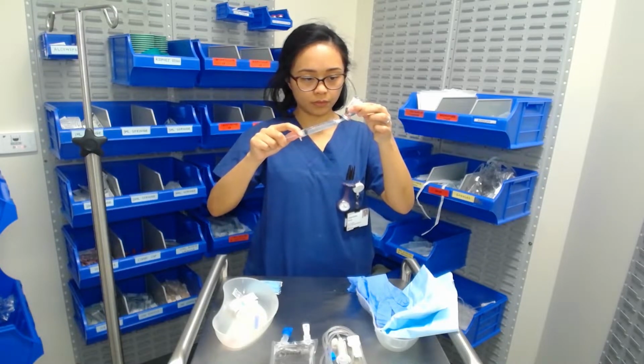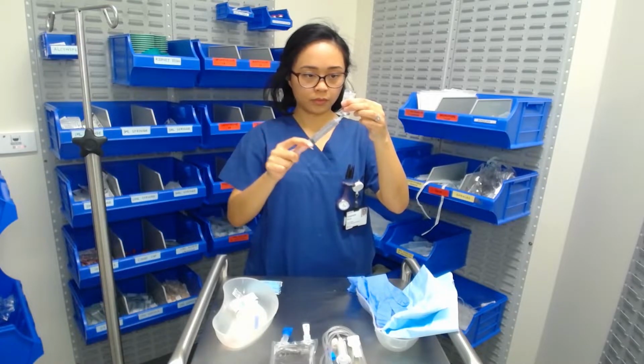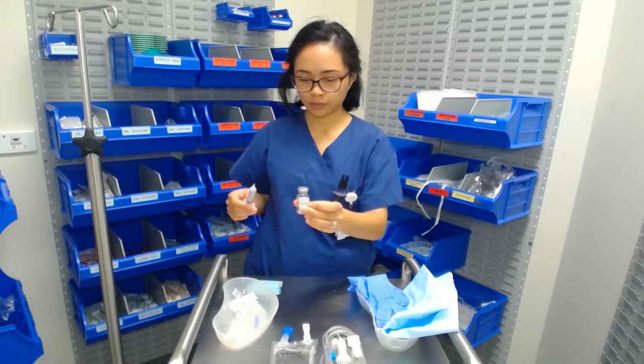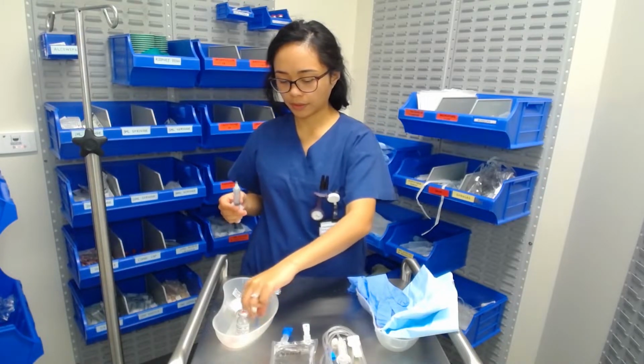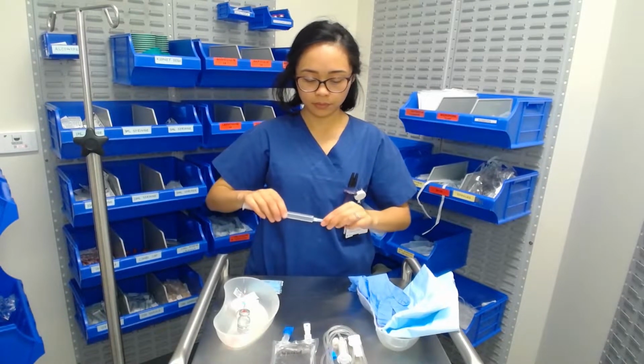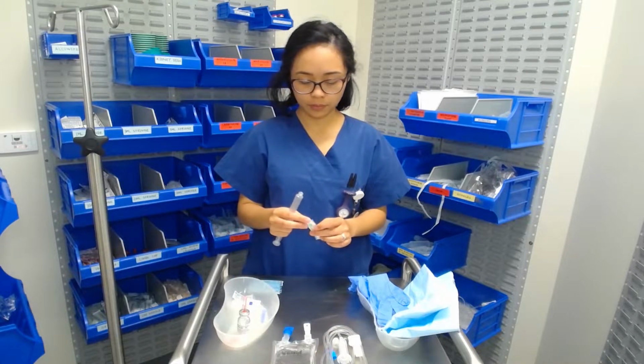I need to make sure that everything is drawn up and there's nothing left in the vial to make sure that I have the accurate dosage. I can place the cap onto my vial access cannula, and I can now attach my actual sharp, the 21 gauge needle.